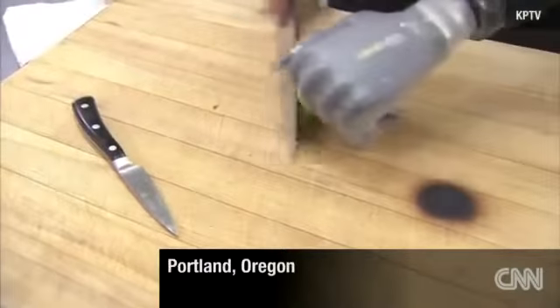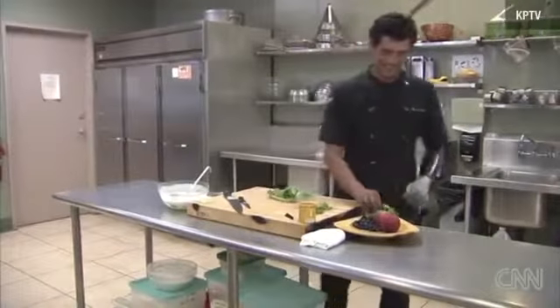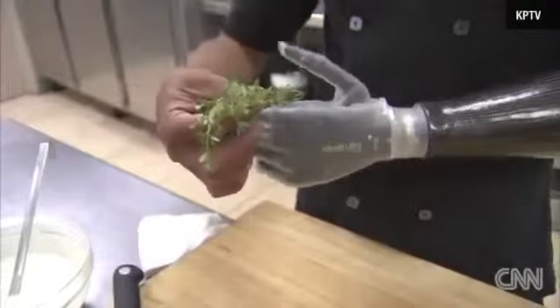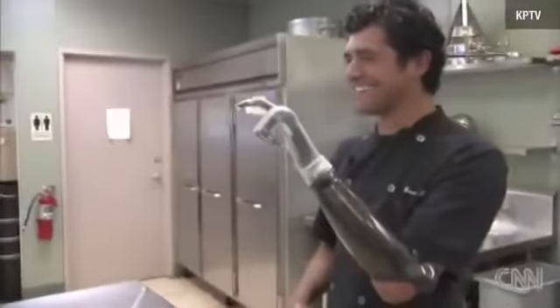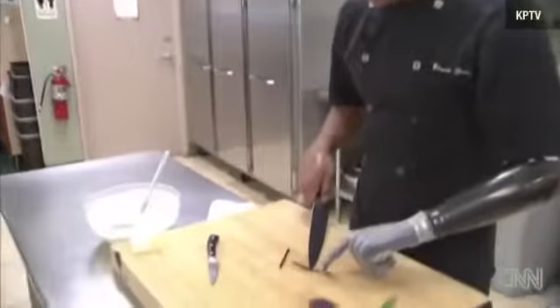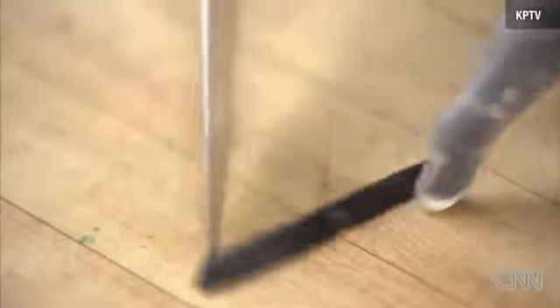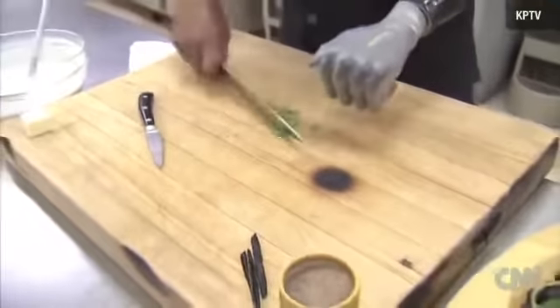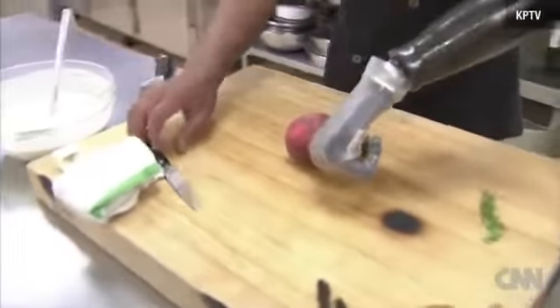He's had his new hand for less than 24 hours, but the Seattle-trained chef from Bozeman, Montana is getting the hang of it. Control's good — it's almost too smart for me right now. Still, Eduardo Garcia is already able to deftly slice a thin vanilla bean, chop, and more. It helps that Chef Garcia is right-handed and that it was his left hand that he lost.